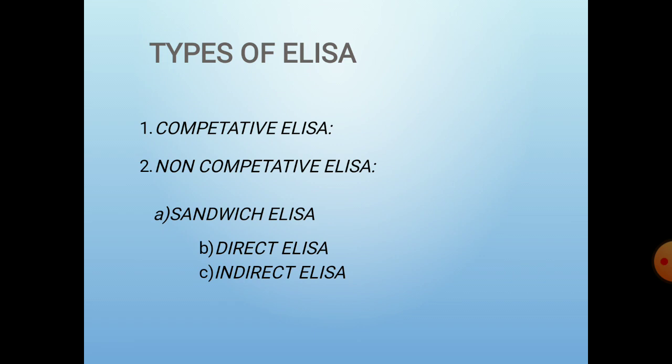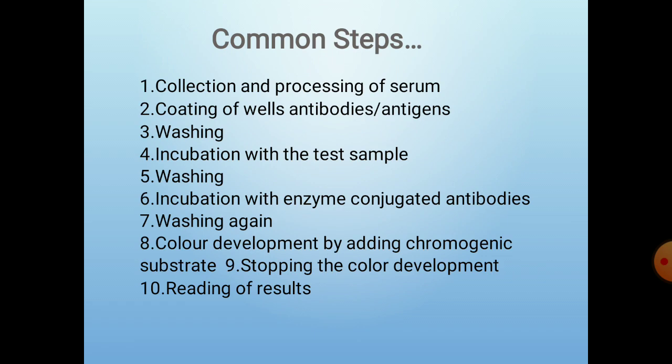Types of ELISA: competitive ELISA, non competitive ELISA, and sandwich ELISA, which is further divided into direct ELISA or indirect ELISA.